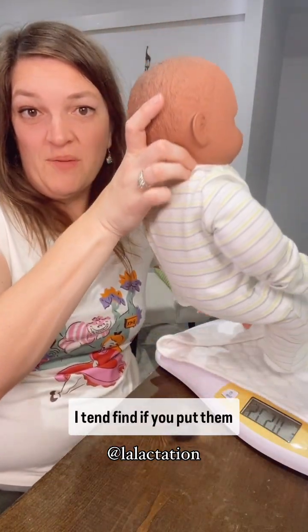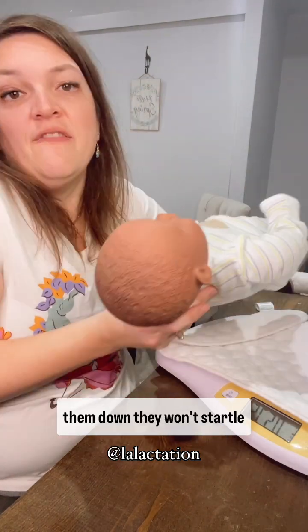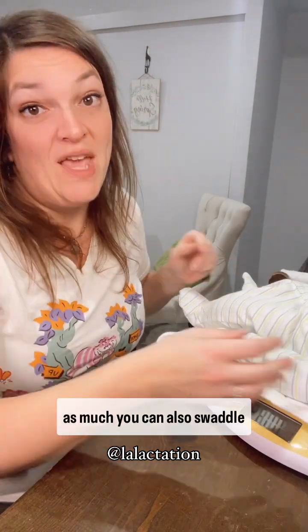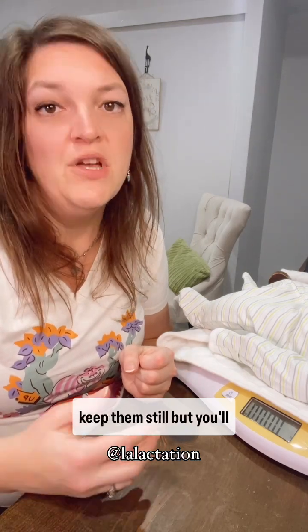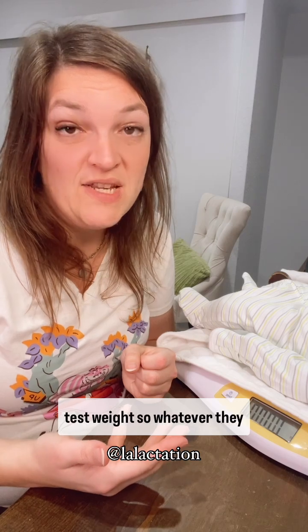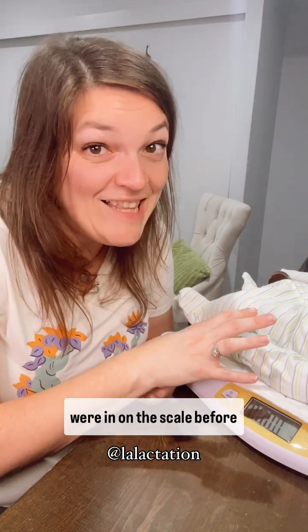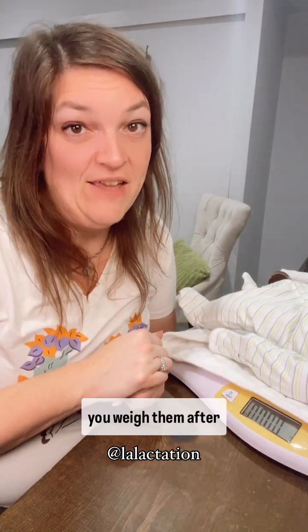I tend to find if you put them down butt to head and gently roll them down, they won't startle as much. You can also swaddle the baby if you need to to keep them still, but you'll then need to swaddle them again when you do your post-test weight. Whatever they were in on the scale before, make sure they're in that same thing on the scale if you weigh them after.